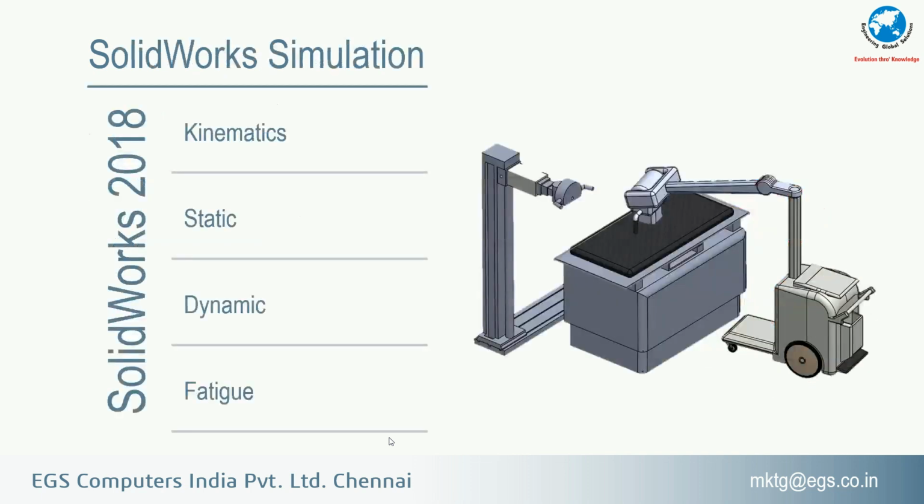Now let's come to SolidWorks Simulation, where we can virtually validate a product, whether it is withstanding the real-time working condition or not. So in SolidWorks Simulation we are going to do the list of studies: kinematic, static, dynamic and fatigue. So in this list of processes we will ensure whether the component will withstand the load or whether it will meet up to the mark of the performance.